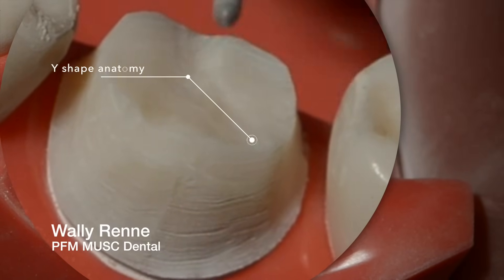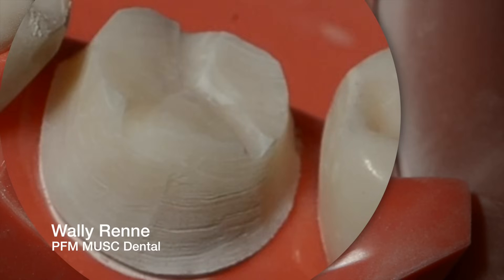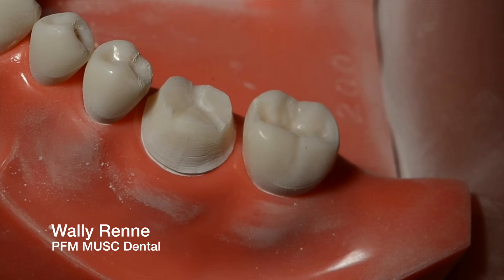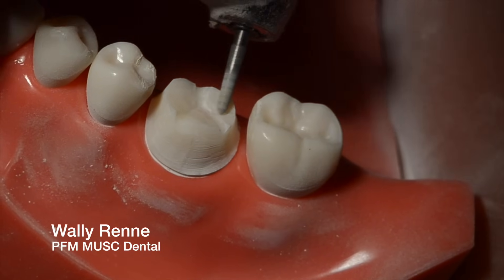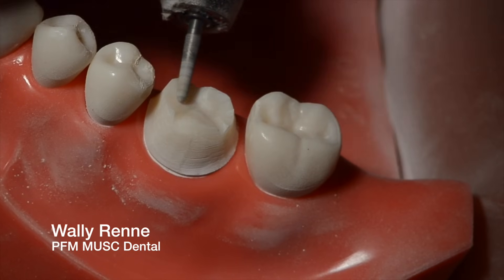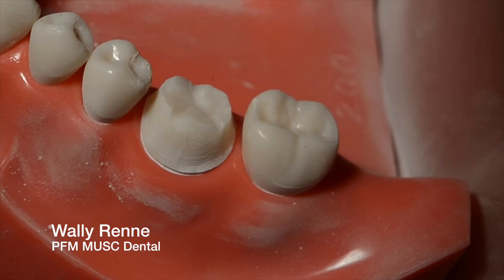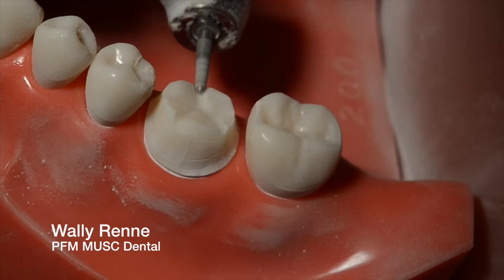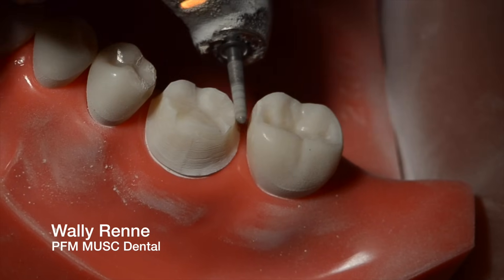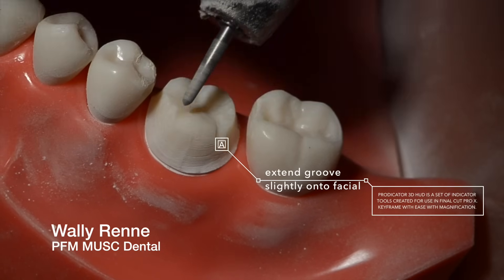So now I'm going to do a Y: a lingual groove and two buccal grooves right there — a little Y shape. I'm going to switch to the 018 because I like it a little bit better for fine-tuning my occlusal anatomy. It's smoother — the bigger the bur, the smoother the cut. Now I'm going to add triangular fossas and transverse ridges, very subtly. You don't want to go crazy, and you definitely don't want to do all this for an all-ceramic prep. This is mainly a porcelain fused to metal anatomical reduction. Rather than worry about keeping the anatomy from the get-go, I just kind of add it back in later.